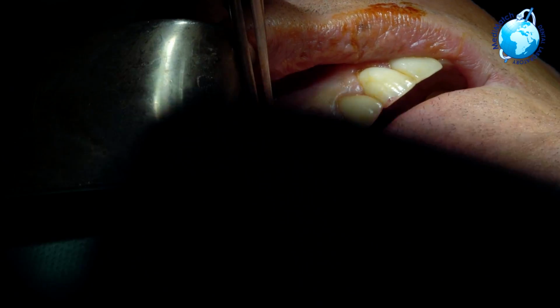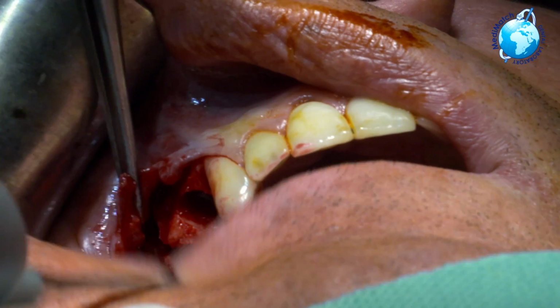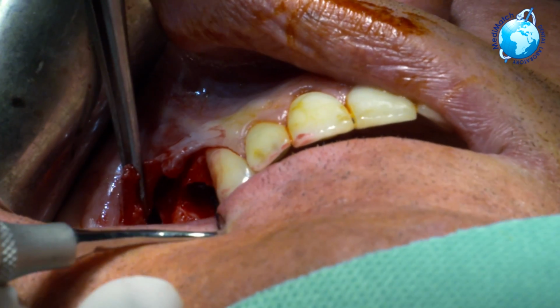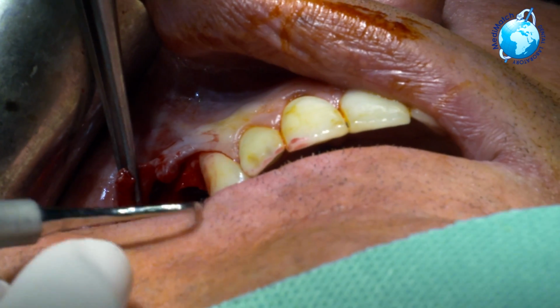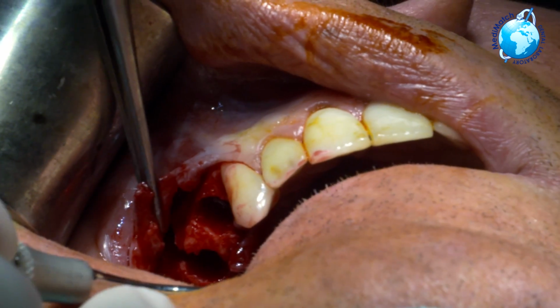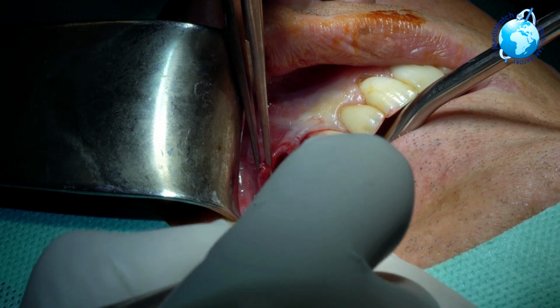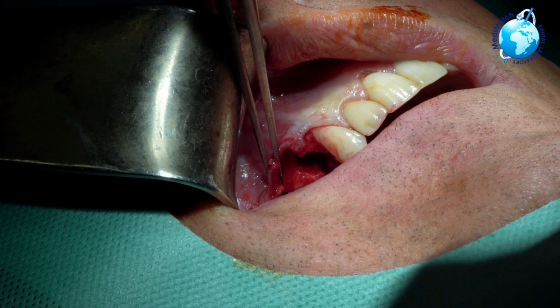Now, in the kit itself, I have a long straight probe, which is blunt-ended. I like to feel the anatomy of the socket, feel where the base of the socket is, and decide on the positions of the implants. We know with the socket we have over 15 millimeters of bone, so we're placing a Megagen 15 millimeter by 3.5 into the socket there. We're doing an internal sinus lift, and we're going about 10 millimeters there, 5 millimeters till we hit the cortical bone in that position. We're going to try to parallel these up.